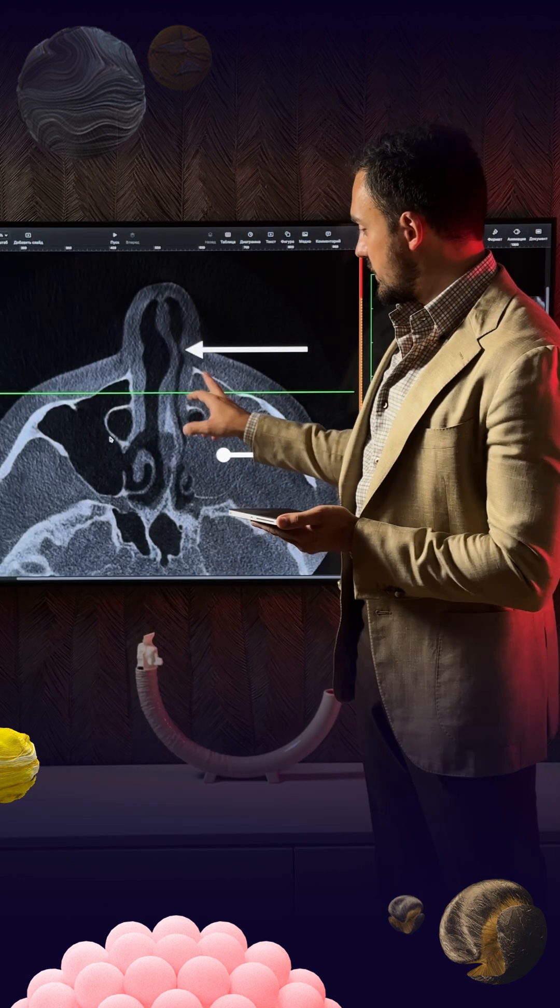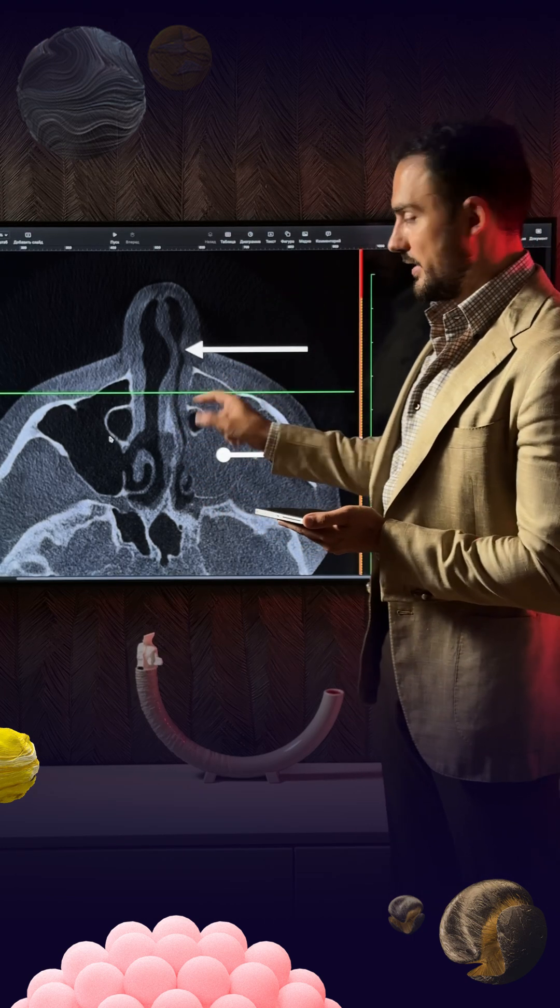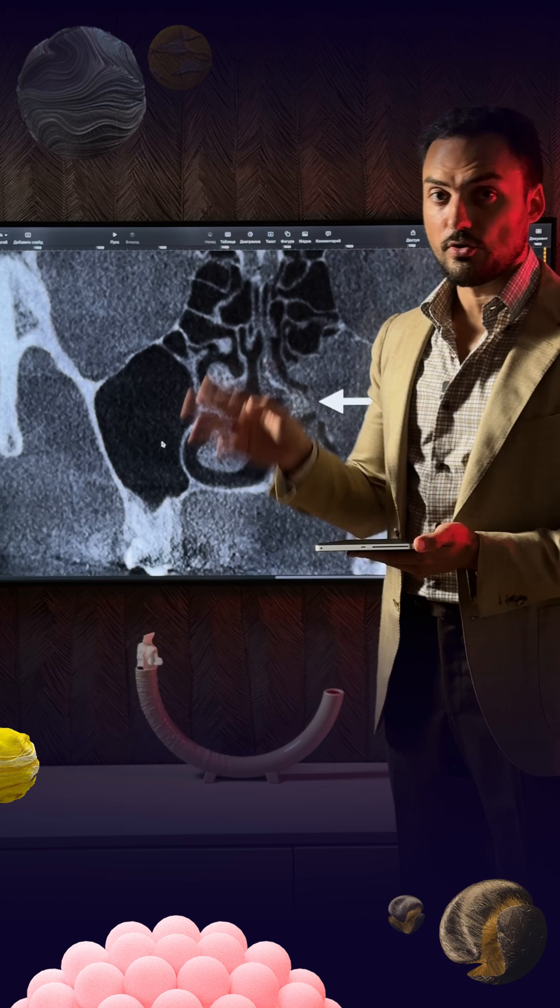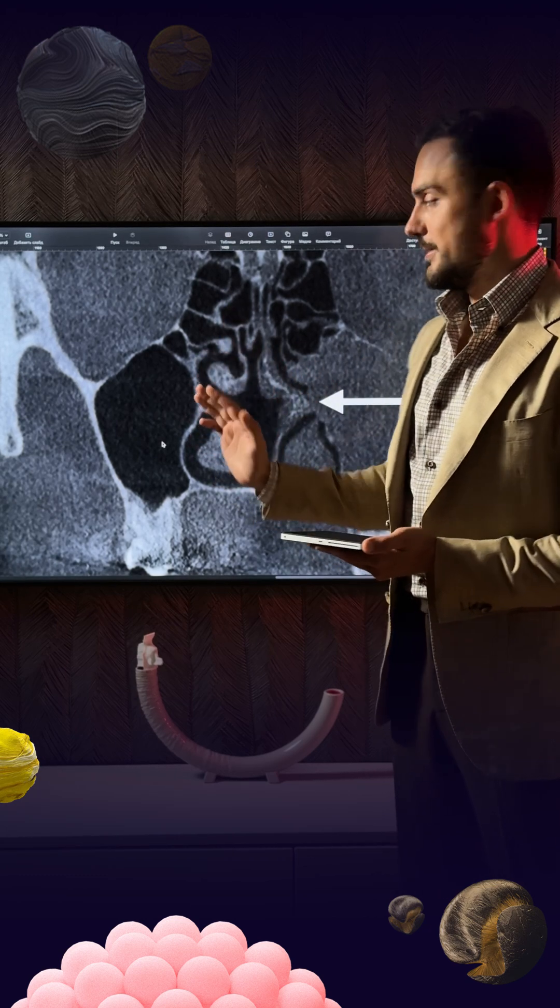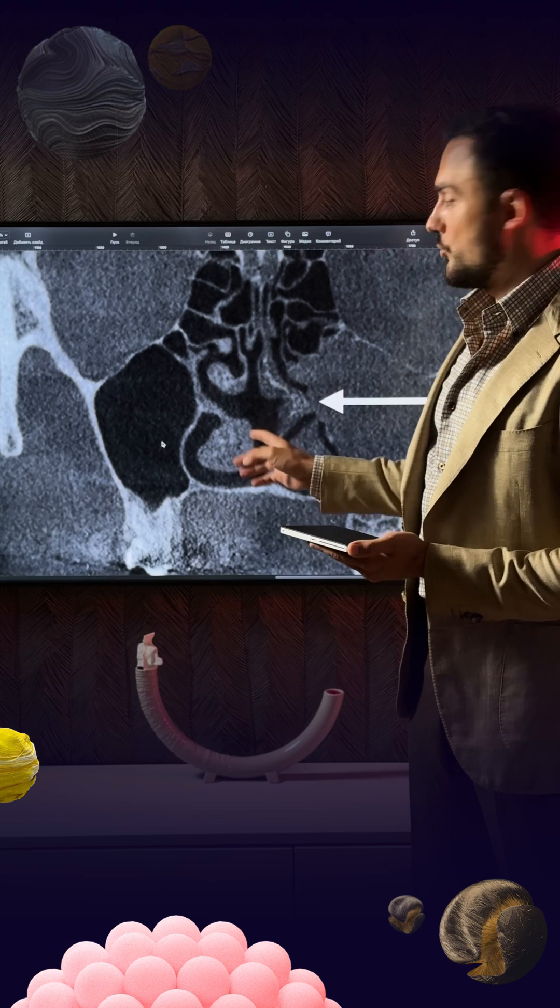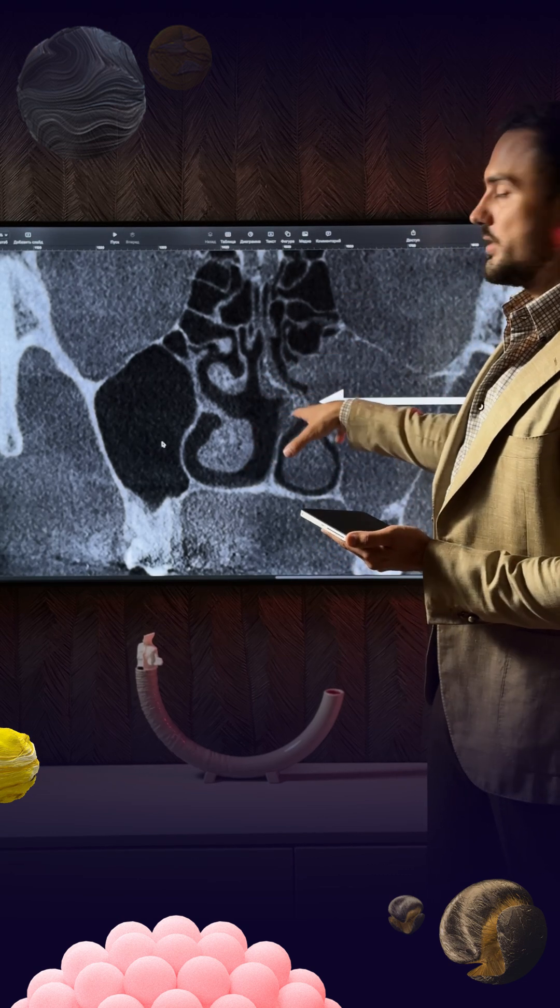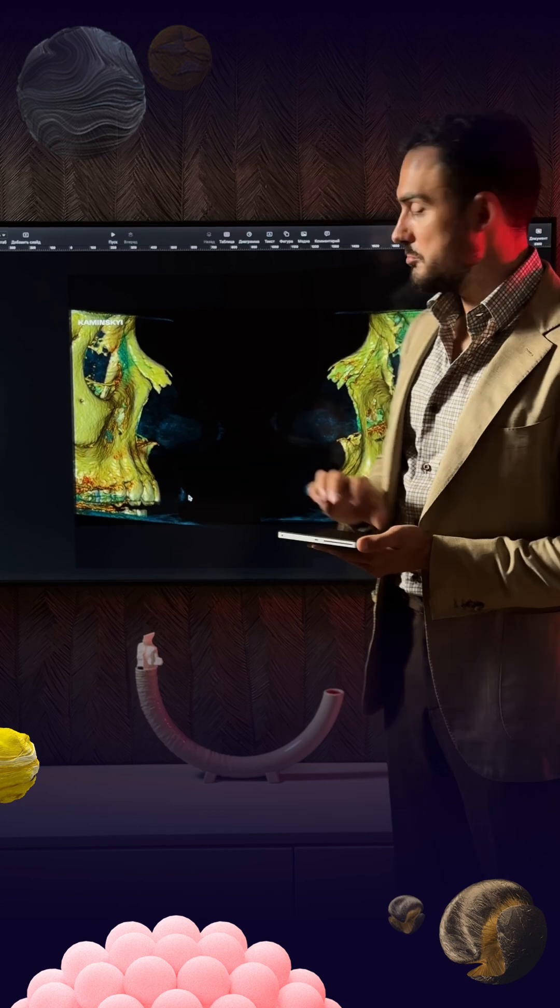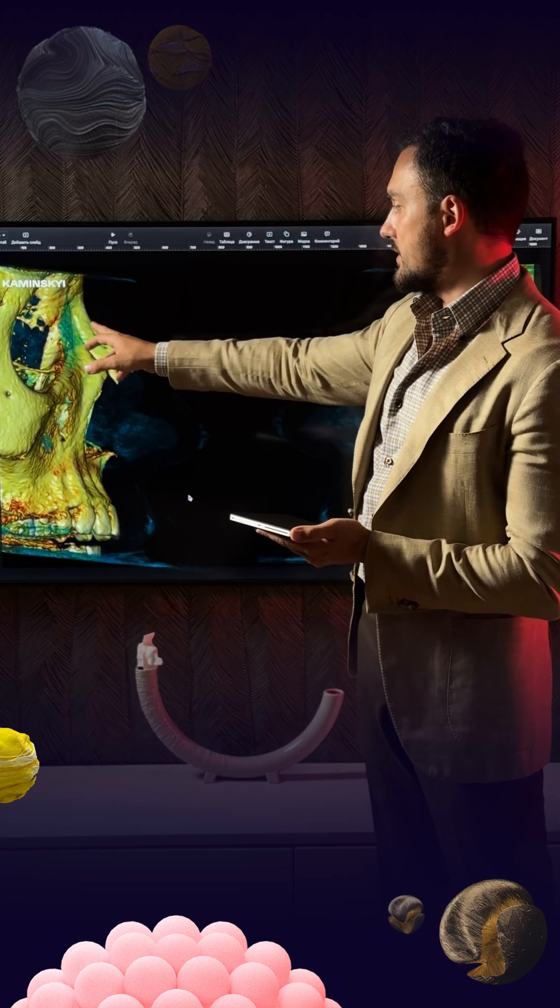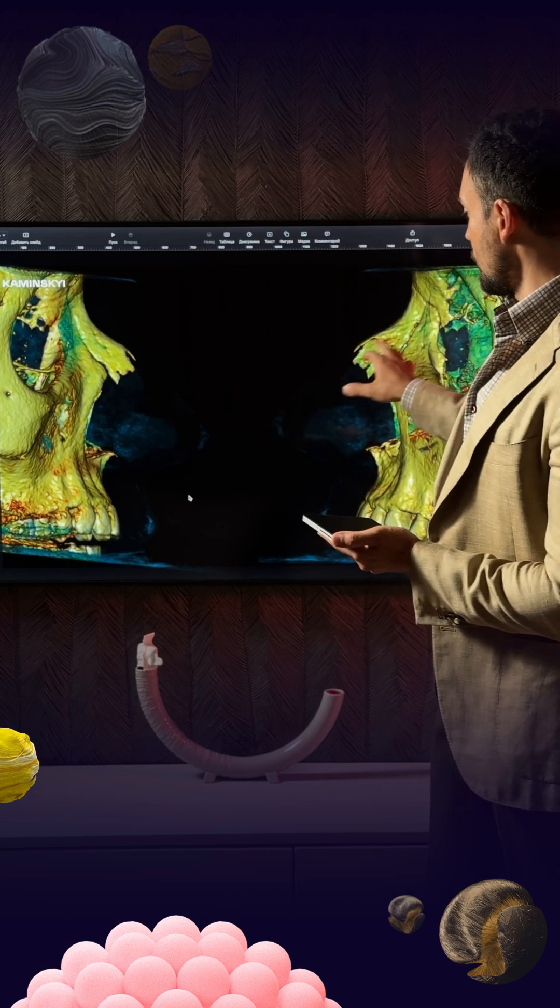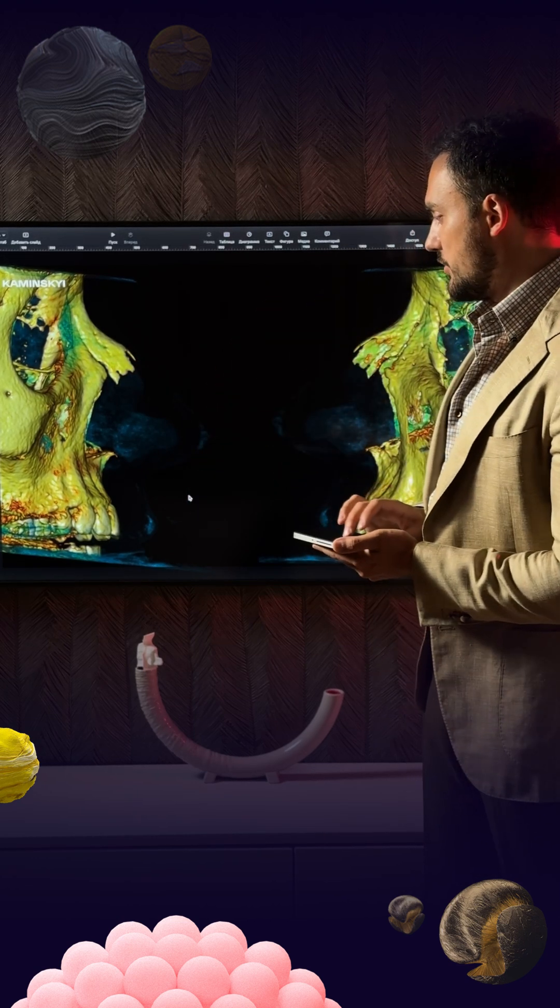Also you can see that she has chronic sinuses on the left side. From this picture also you can see that we don't have only the deviated septum. We have the nasal spur deep inside of the nose. On the 3D view it seems like normal bones, like it's not the S-shaped bone, it's straight bones, so nothing special from the side view.